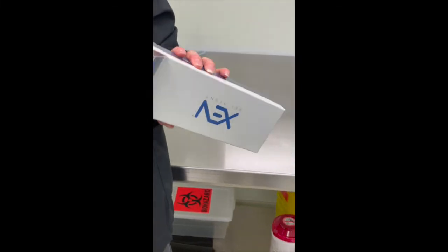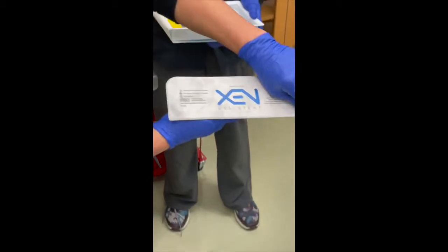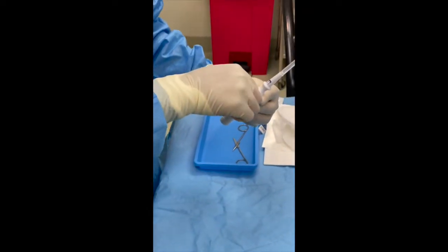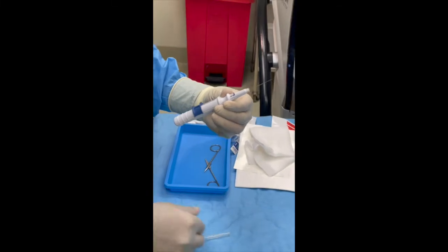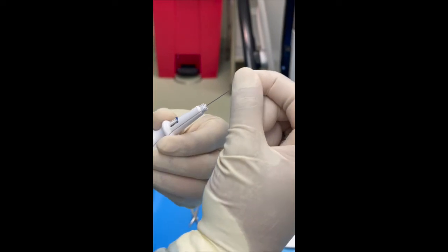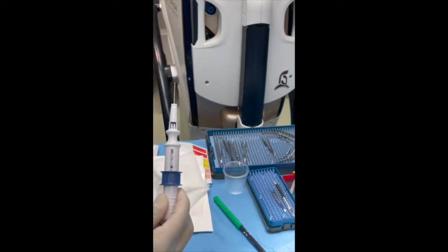We're opening the package. Then what we're going to do, Alex, is pull that yellow knob towards you. Now you've got the clear top — go ahead and pull that off. And then you have a retention pin at the very tip. You're going to use your bare glove or clear forceps to pull that off — and it is a sharp. The Zen is ready. Now just keep it in an upright position with the needle up so that the stent does not fall out.